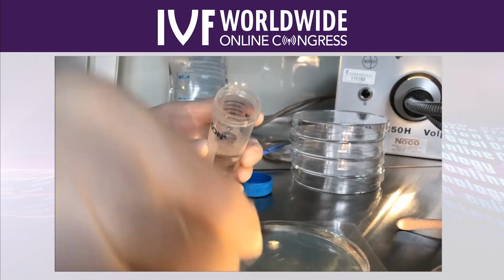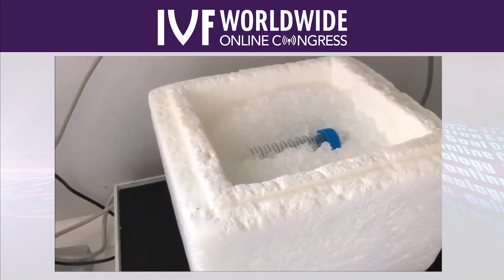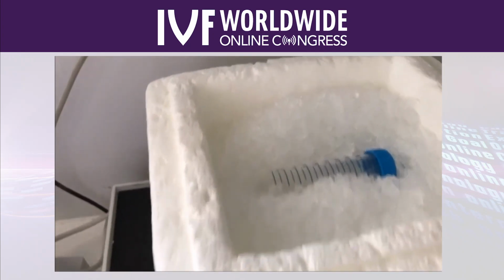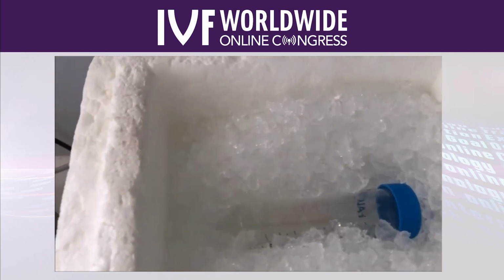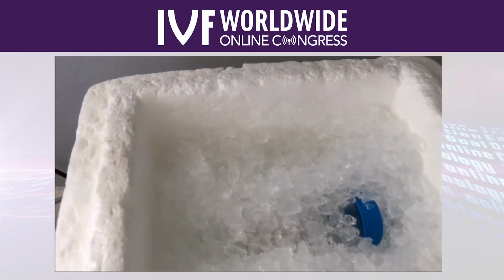And this has to be for 30 minutes on ice. Here you can see we put the tube on ice on a shaking table. You can see the pieces are moving inside, and has to be there for about 30 minutes.